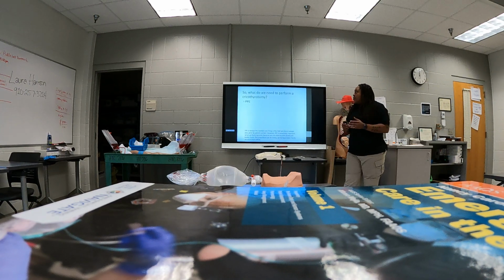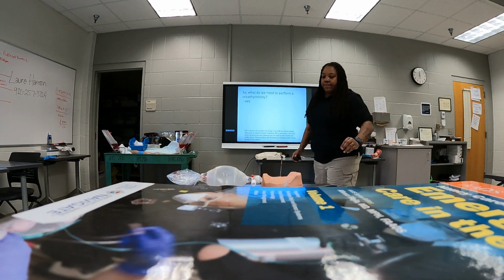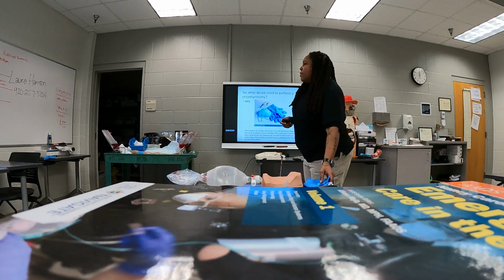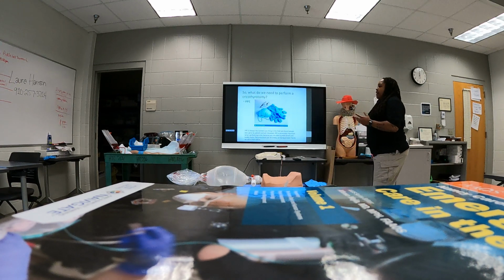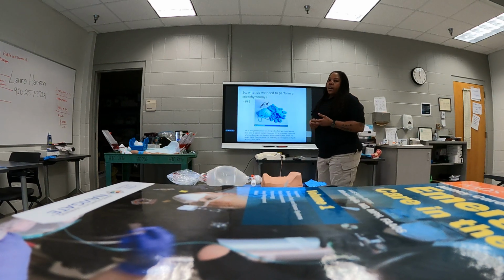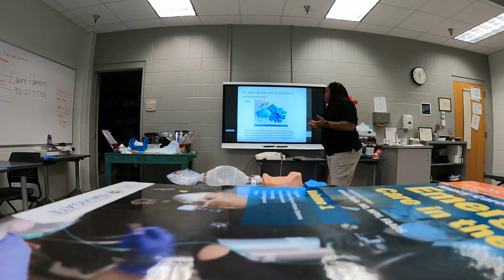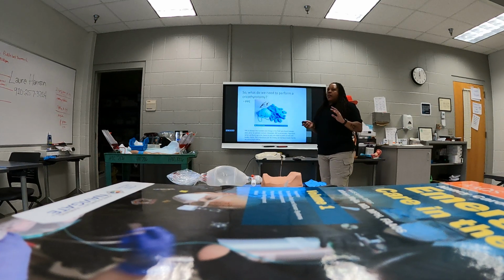Okay. So, what do we need to perform a cricothyrotomy? First, we need PPE. We want to make sure we have gloves and our mask. If you wear eyeglasses, that's fine, but you want to try to make sure you have some eye pro if you can get to it. Just remember that that's the number one thing that's important in the field that we should put on prior to patient contact in any type of call we go to. It's extremely important when we're performing a cric because you're dealing with blood and bodily fluids. This procedure can get kind of messy, so a couple of towels being around probably wouldn't hurt.